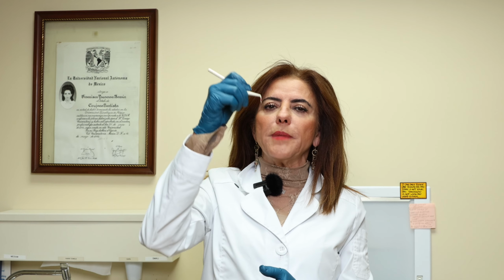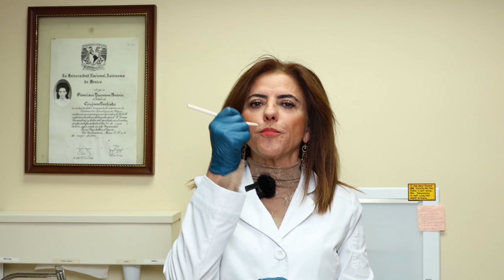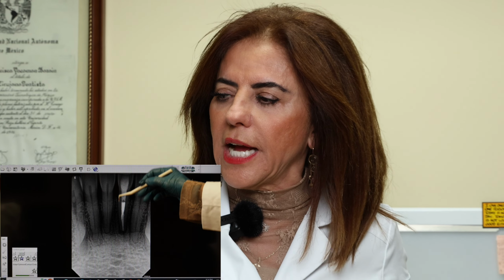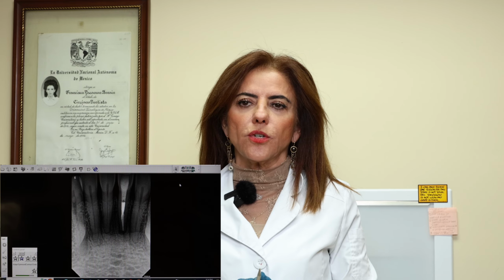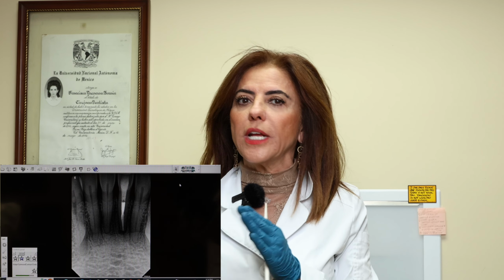And also we have to measure with this periodontal device. It's a perio probe, and we start measuring the gums of one tooth after the other and see if it goes all the way inside. Like in this case, if when I did a probing I would have this going all the way inside, there would be an 80% possibility that it can be a crack or a root fracture. And to confirm, if you don't see it, then they're going to send you to have a CT scan. So not everything is X-ray.